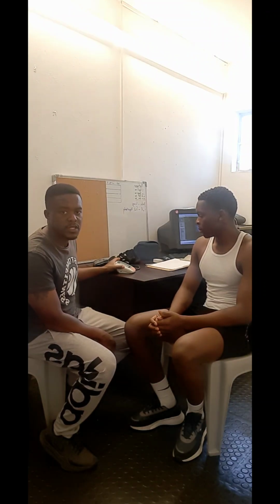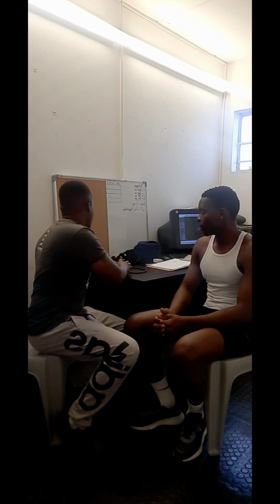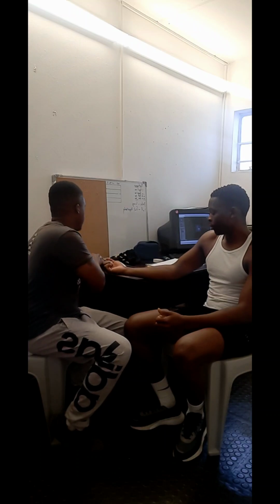So to get my client's blood pressure, we are going to use the blood pressure machine to get my client's systolic reading and diastolic reading.